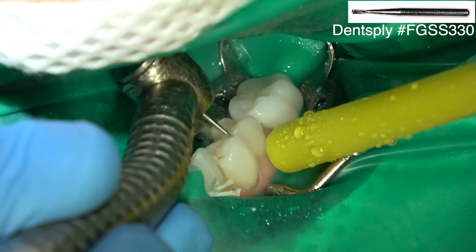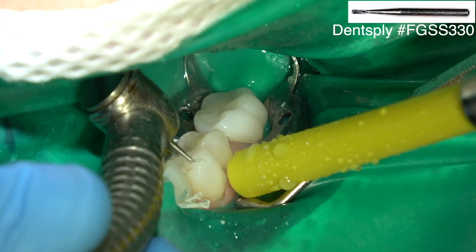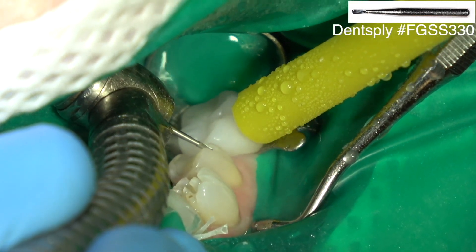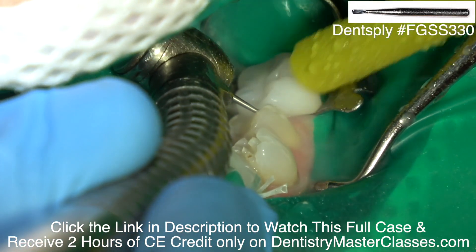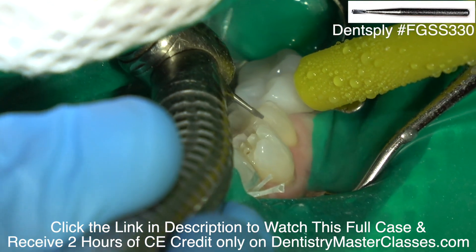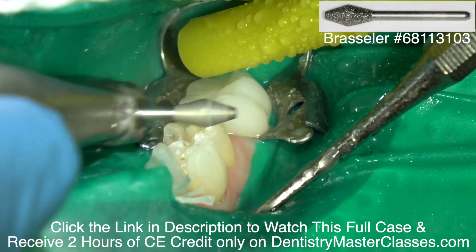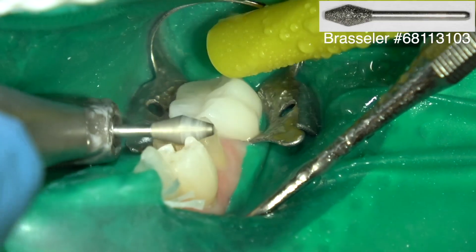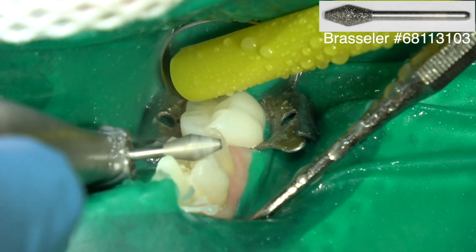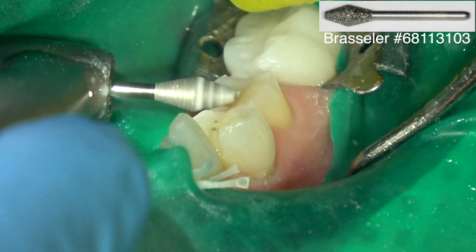In the mandible, I place full crowns on the bicuspid teeth and then veneers on the mandibular anterior teeth. I'm reducing the occlusal surface of the bicuspid teeth approximately two millimeters. This 330 carbide burr is two millimeters from here to here, so that's just my depth cut so I know how much to reduce. This is just an occlusal reduction burr, so I'm not having to think about how much occlusal reduction I need to prep because I've already got the depth cuts and I just prep to the bottom of the depth cut.